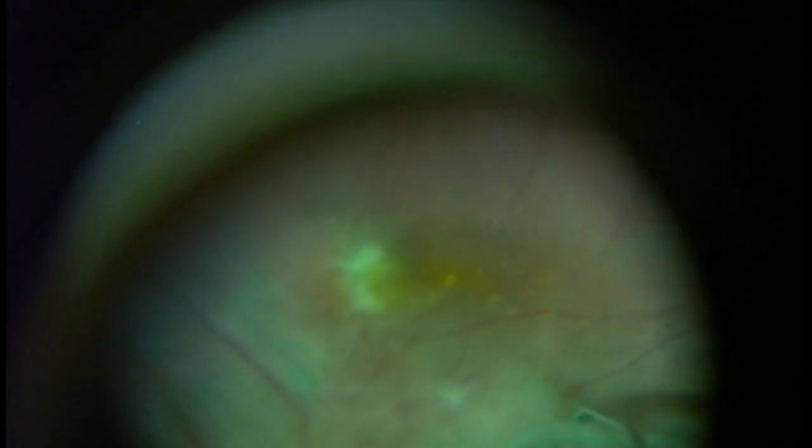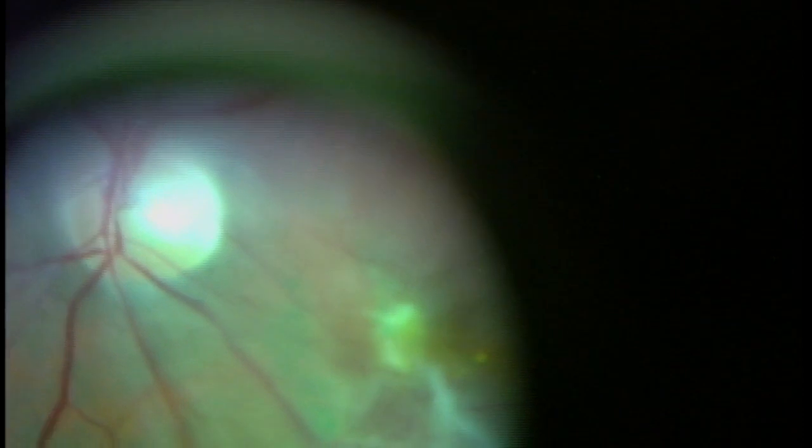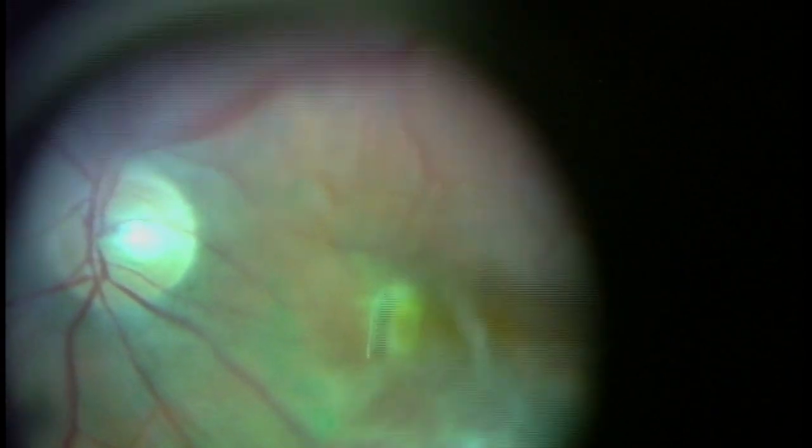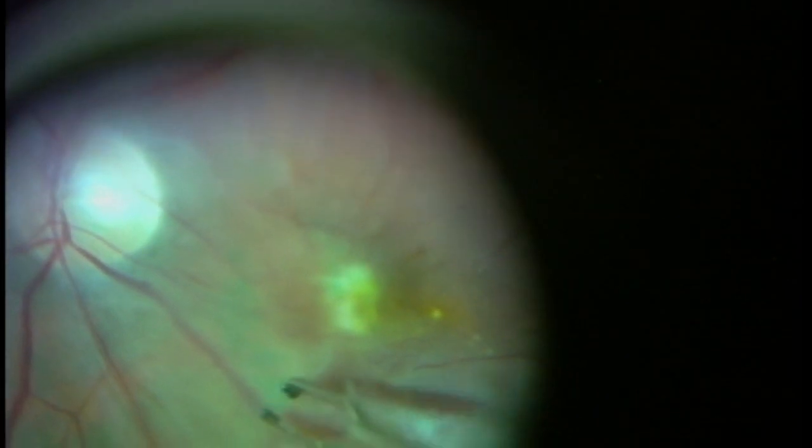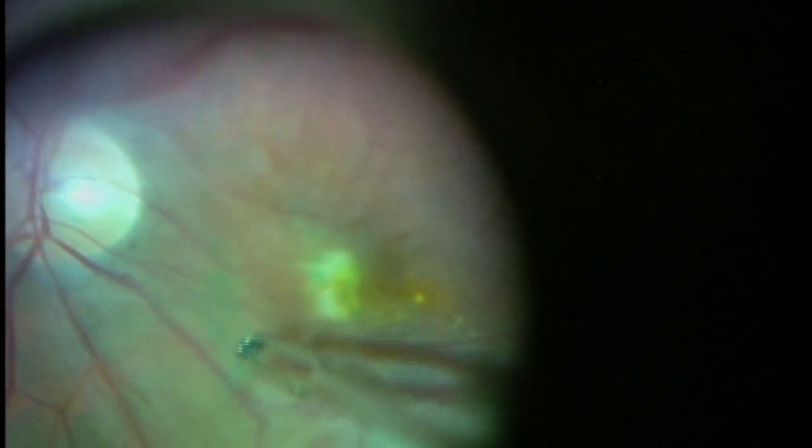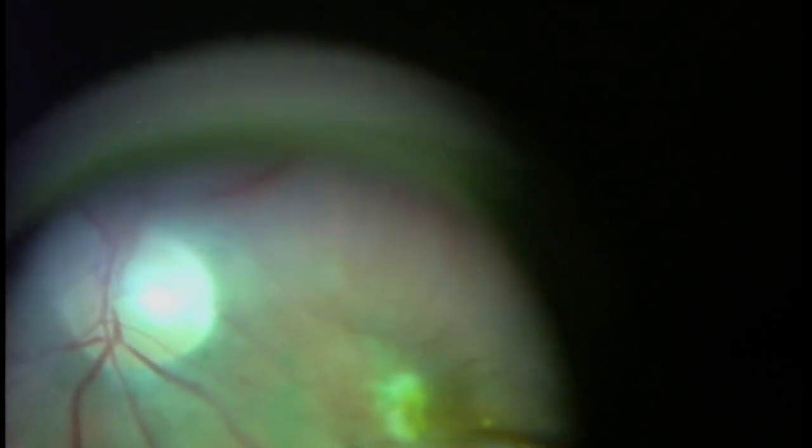I apologize for the decentration. Sometimes I get so focused on what I'm doing, I'm not really paying attention to centering the microscope. My view when I'm operating is actually much wider than what you're seeing here in the video. So I'm going to go around the macula and get up the extra epiretinal tissue as much as I can.